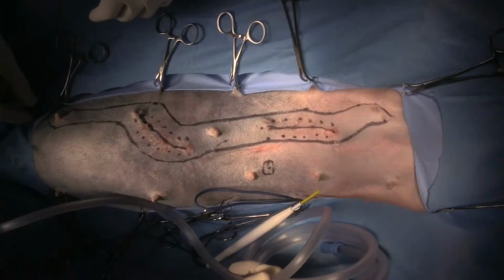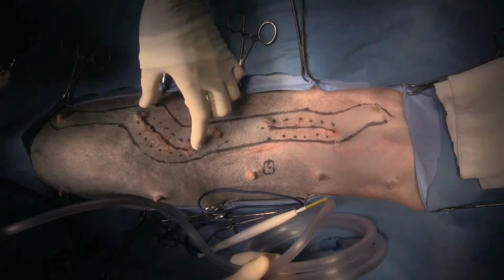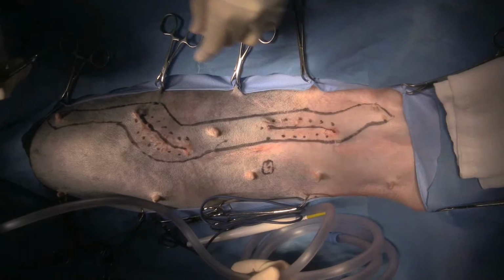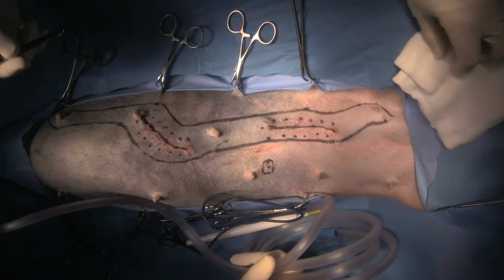Today we are doing a radical mastectomy in a dog that had previously excised mammary cancer. If we look here on the left chain, we have this previous excision of a low-grade mammary gland carcinoma with dirty margins, and then we've got a clean margin down here. We've also found another lump on the opposite side down here. Also, we're going to spay the dog at the same time because that's been shown in at least one study to improve survival following mammary gland cancer surgery.